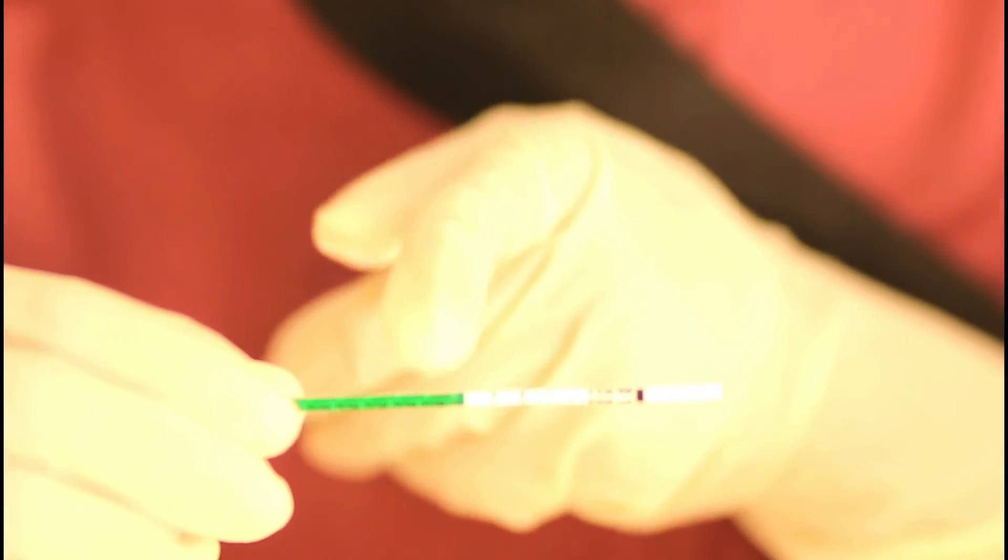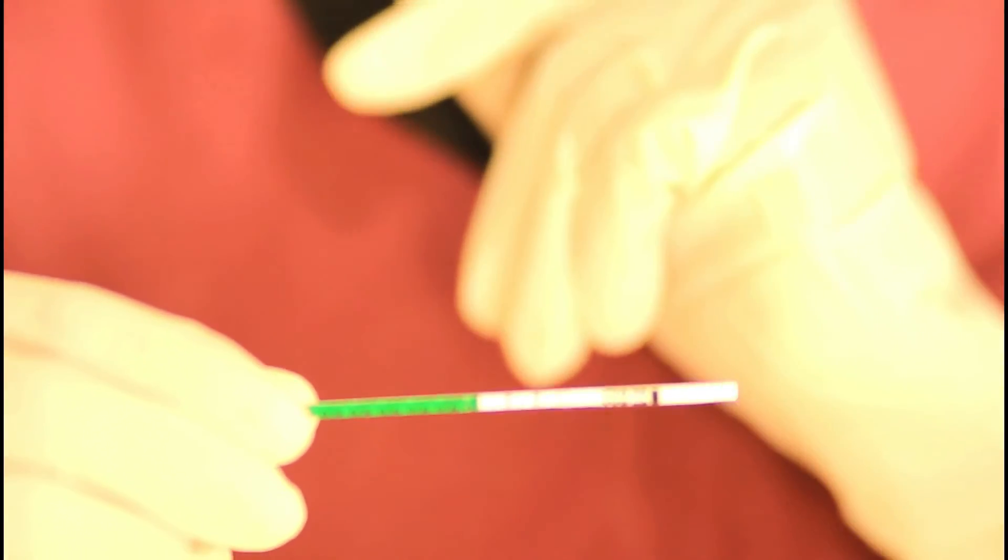Five minutes is over and unlike the first test we can see that we have two lines. The control line as usual is there and there's a second line which is the test line that shows that it is positive. Let's put the first test so that you can see. The first one is the negative result and the second is the positive result.